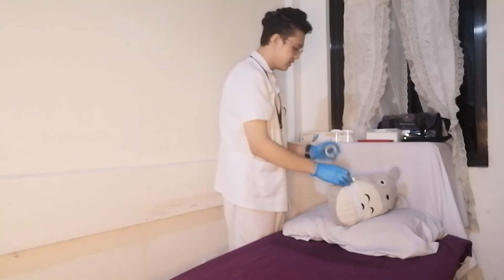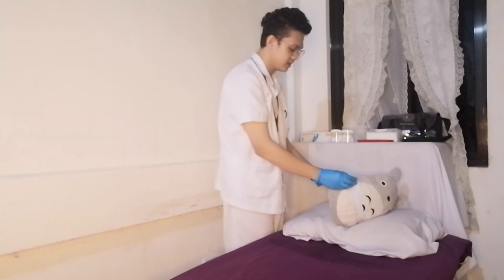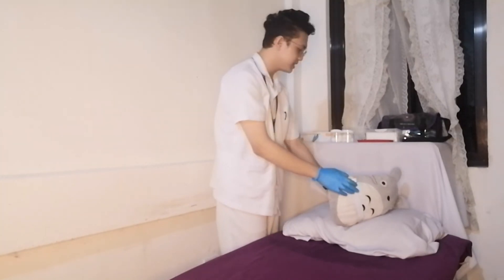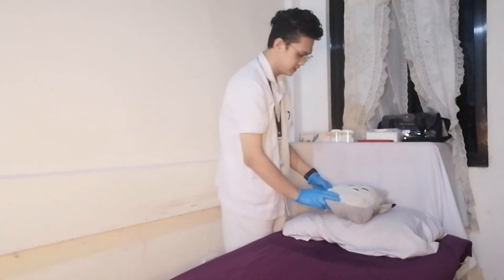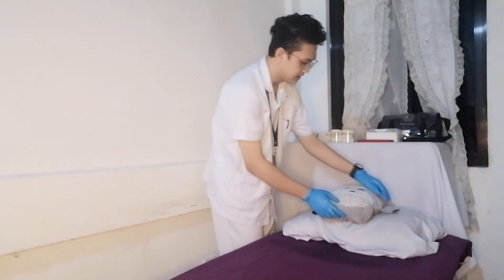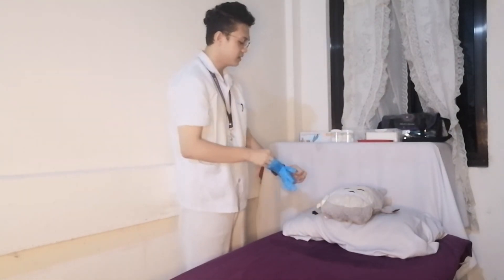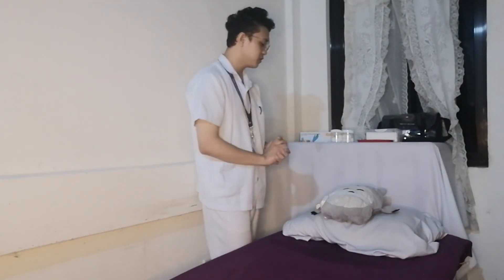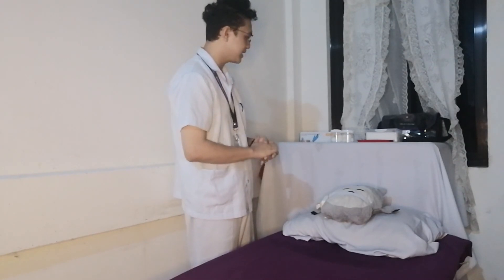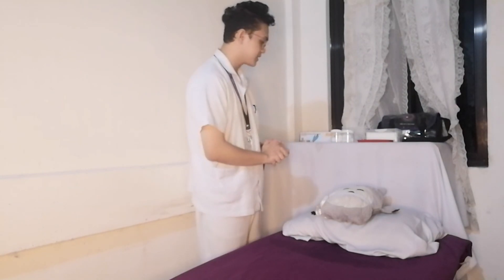I'll be taping the cotton ball swab. I'll be assisting you to a comfortable position now. I'll be documenting the drug administered, the time, and the dosage. Mr. Totoro, you have been a wonderful patient. Thank you for cooperating. If you need anything, just call me and use the nurse's call button.